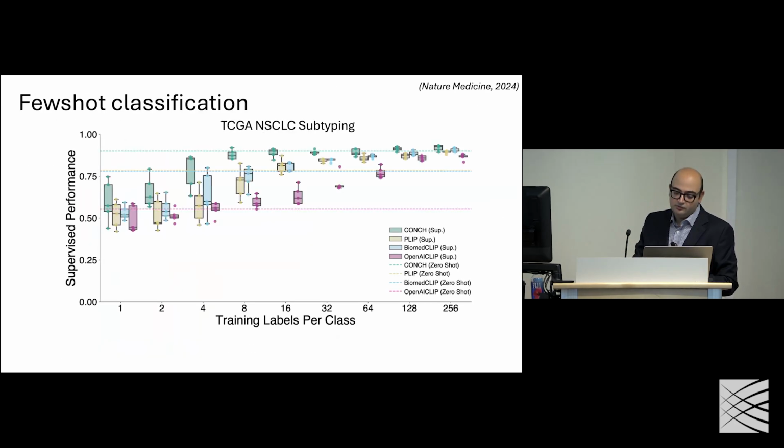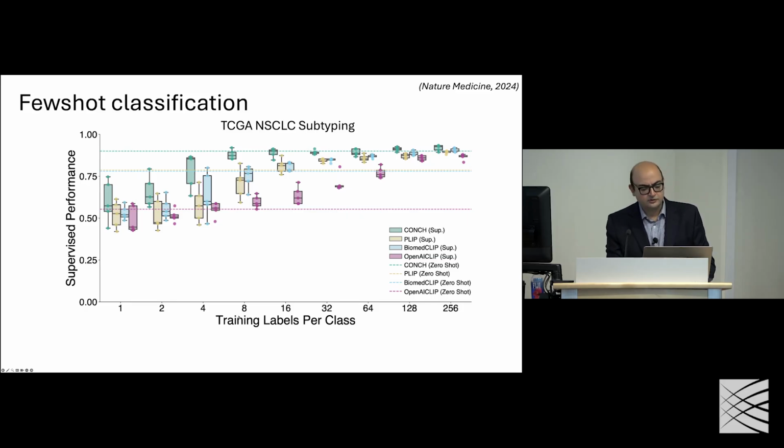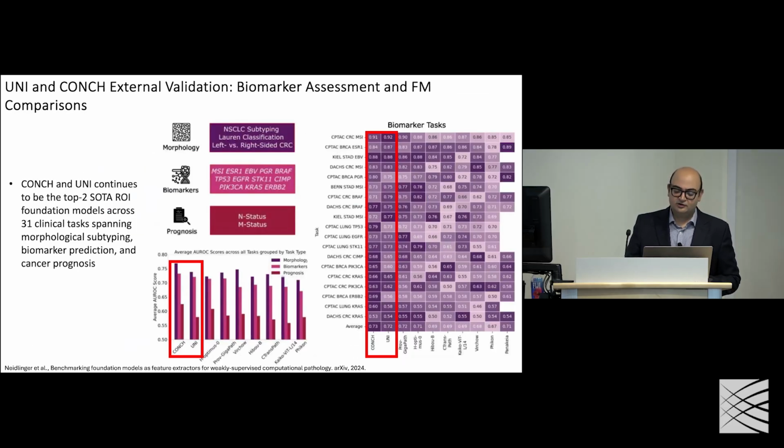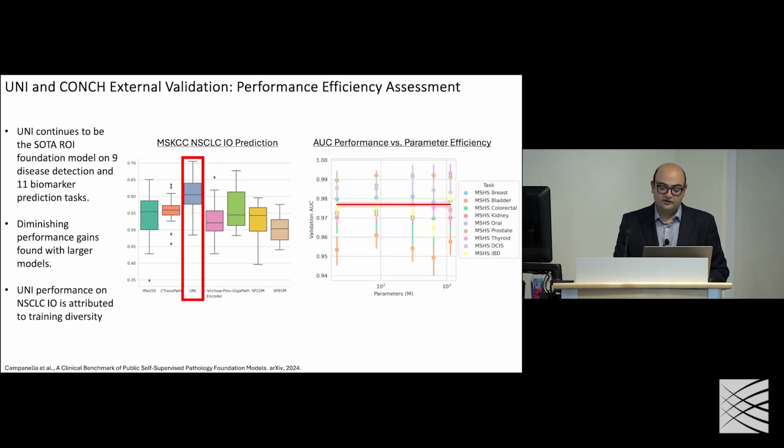We showed that you could improve representation, and there's a lot of analysis around how this compares to image only. This example is for few shot learning, and we can already begin to get clinically useful performance using about eight or nine slides. There's been quite a lot of independent validation of these models. Here's some validation that came from Jakob Kather's group in Dresden, and there's also some validation from Thomas Fuchs's group at the Memorial Sloan Kettering Cancer Center and from Mount Sinai, where they've used this on their own data.